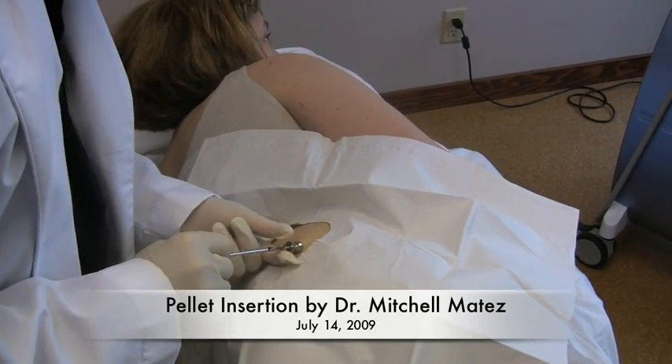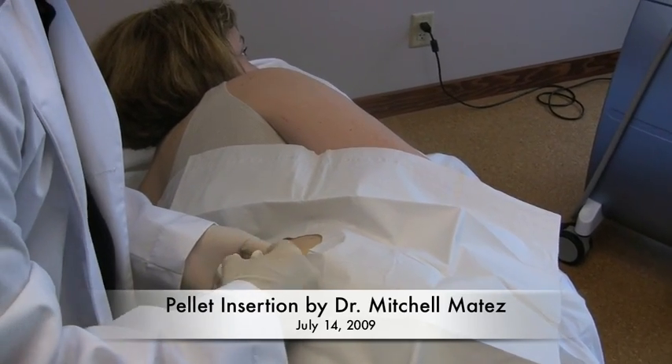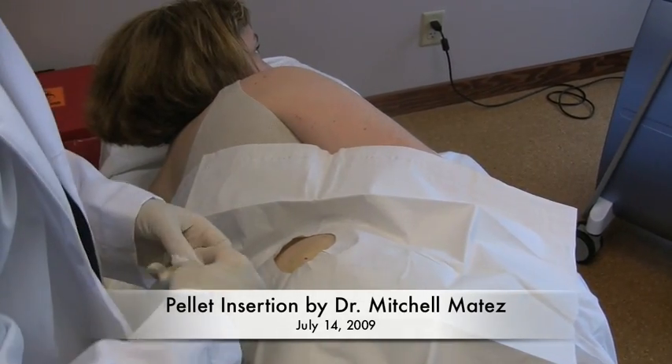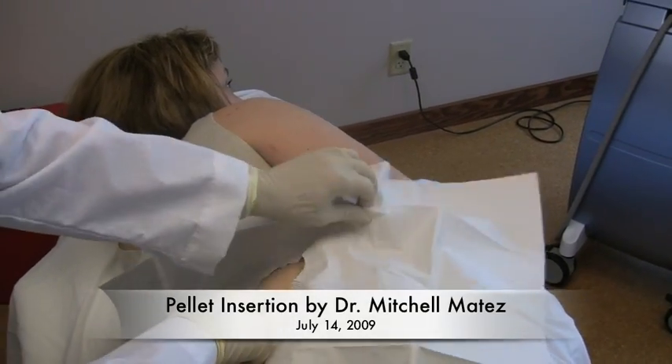You will now feel just a couple little pops — little pressure pops — but they should not be painful at all. You ready? And we're done. We're going to hold a little bit of pressure here for a minute and get a dressing on you, and you will be on your way.